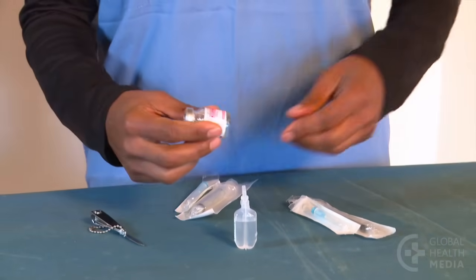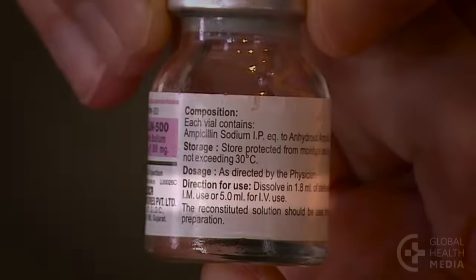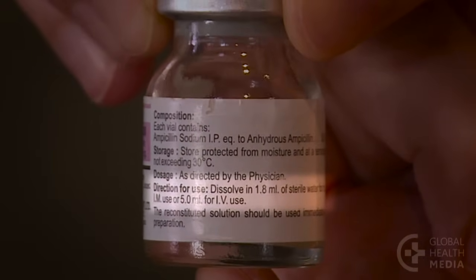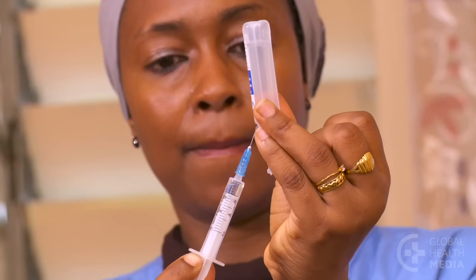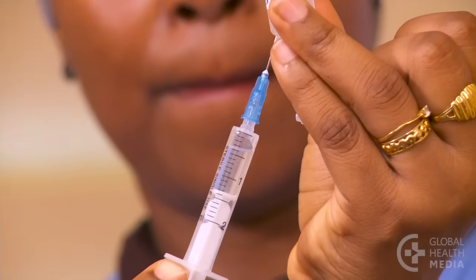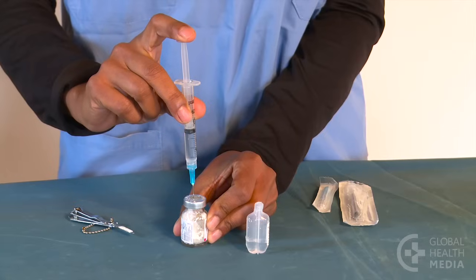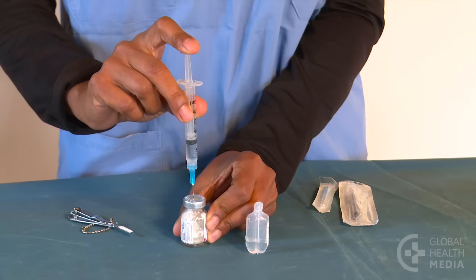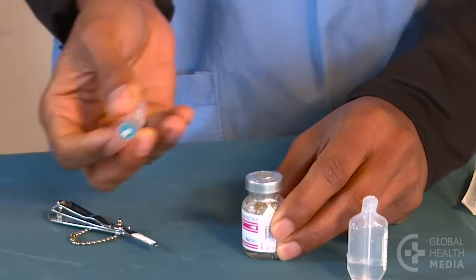Now prepare ampicillin. Follow the directions on the bottle to prepare the medicine. Draw up 1.8 milliliters of sterile water and add it to the 500 milligram bottle of ampicillin. Shake the bottle to mix the powder and water until it is completely dissolved.